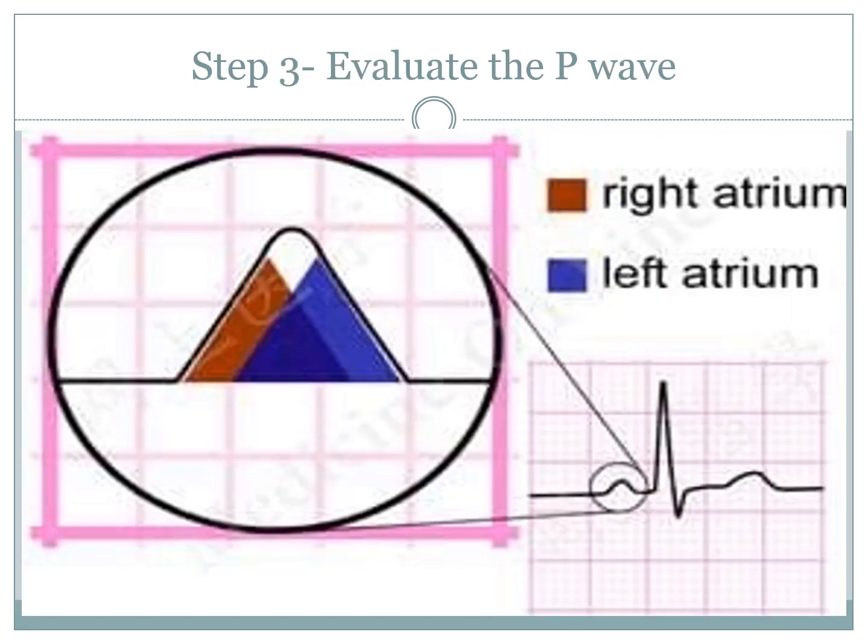Next, we look at the P wave. We want to know if P waves are present and if they are normal, so do they have that nice dome shape? Does the P wave always follow, and is it always before every QRS? That's what we need to know when we're looking at the P wave, and note if there are any differences.